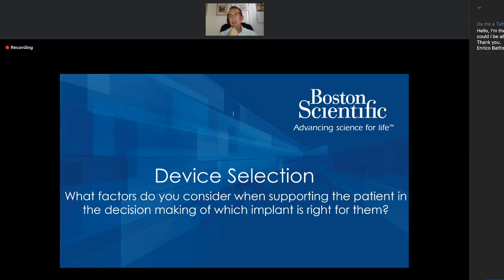Do you tend to have the partner present when you're having the consultation, or no? Yes, for sure. Every time I show the prosthesis, I show all the types of the prosthesis. I have the malleable, I have the three pieces, the two pieces. But the largest part comes to me, asks me for the three pieces, and then I show the device.